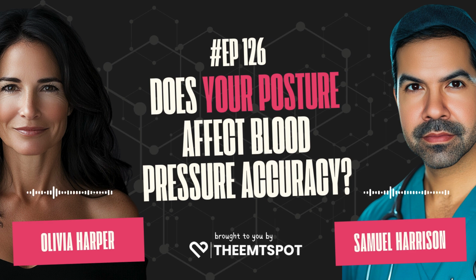So let's talk solutions. What can we do to reduce the risk of both overdiagnosis and underdiagnosis? It seems like we need a way to make sure everyone's playing by the same rules when it comes to blood pressure measurement. Absolutely. Standardizing those techniques is essential. Healthcare providers need to be following the guidelines rigorously, using the correct cuff size for each patient, making sure the patient is positioned correctly, and allowing for that all-important rest period before taking the reading. Those 5 minutes of quiet time really do seem to be more important than most people realize.